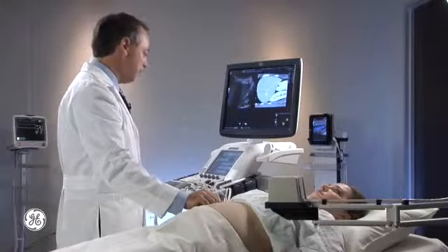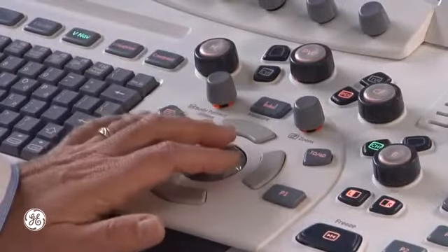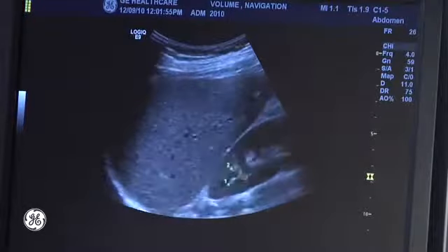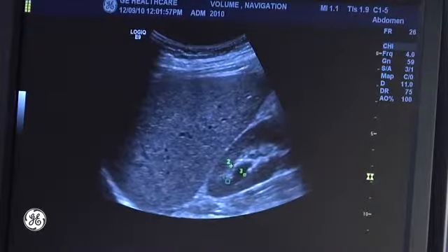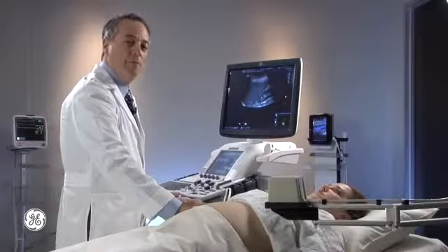Another benefit of GPS markers is you can use it just for ultrasound. So if I'm just tracking specific areas and I may have to approach them from a different location, I can use GPS markers to find that same location from a different orientation. These are just a couple of examples of how GPS markers can also help you in your clinical study.